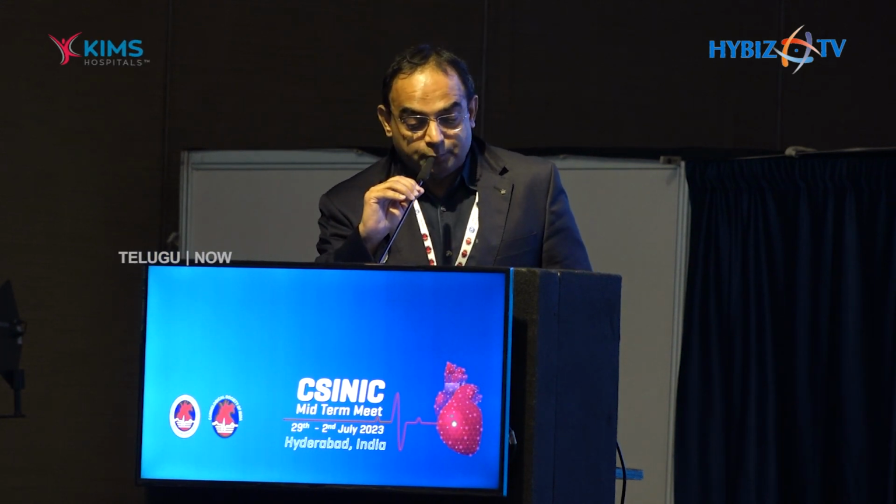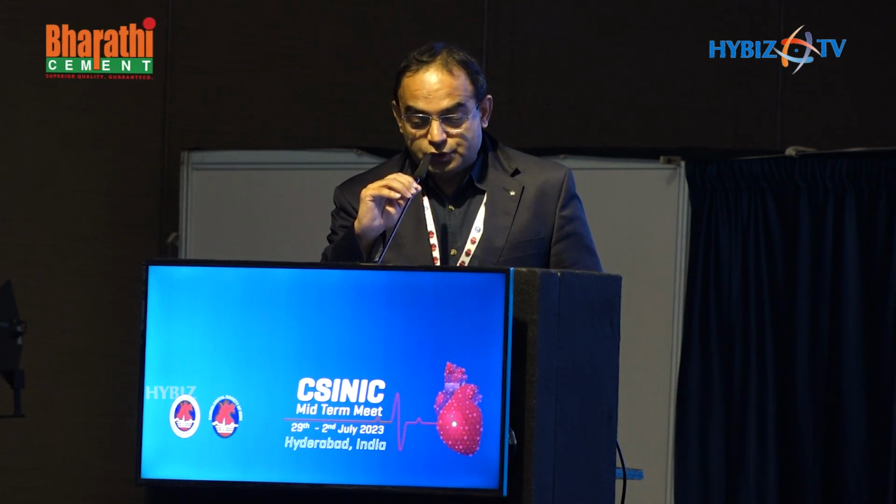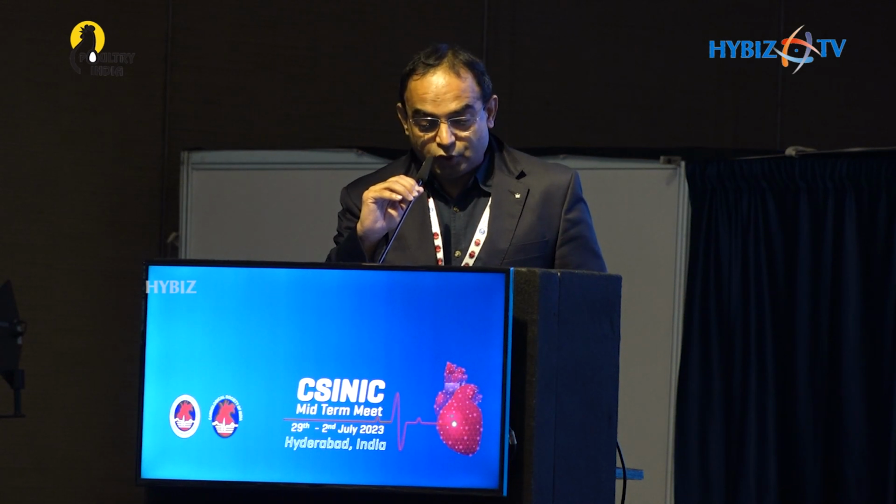And this was the angio on the repeat procedure after 48 hours. The patient was on IABP, and this is the angio which shows a significant distal LM lesion extending into the proximal mid LAD, and a circumflex which is a dominant circumflex. The RCA was non-dominant. So we decided we'll go with image-guided LMCA to LAD stenting.